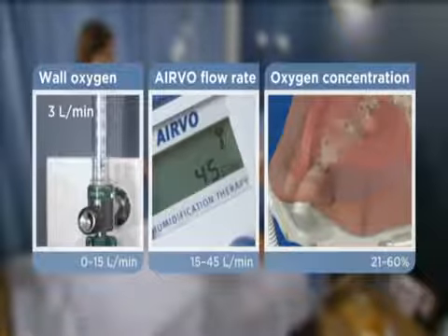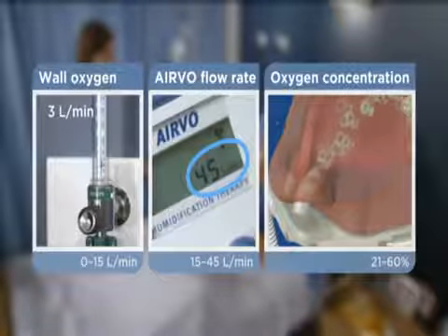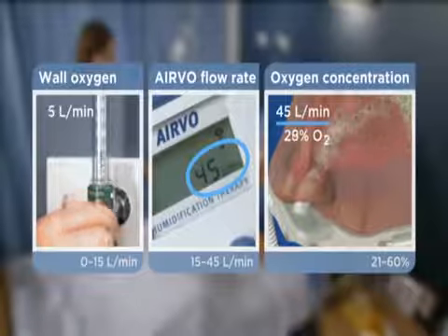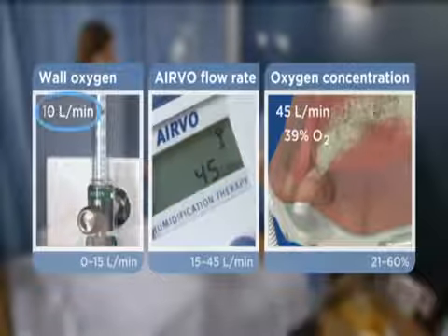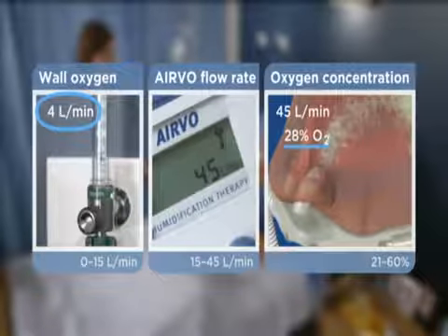So, if the Airvo flow rate is 45 litres per minute, the patient will receive respiratory gas at 45 litres per minute, whether the oxygen flow is 5, 10 or 15 litres per minute. Altering the oxygen flow rate only changes the concentration of oxygen in the respiratory gas.